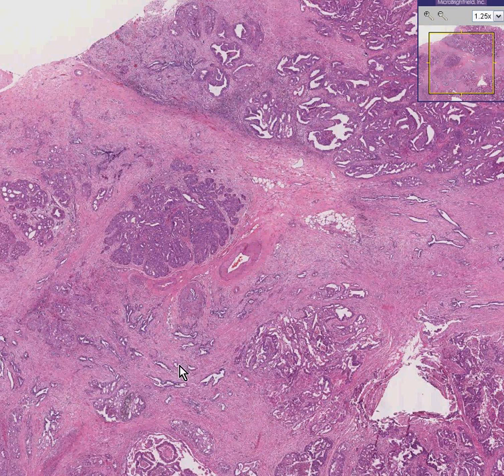Here is another ovary. You might have a hard time believing that because there are no features in this tumor that appear like normal ovary.